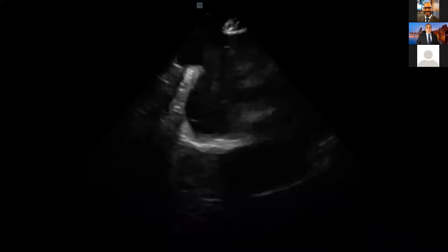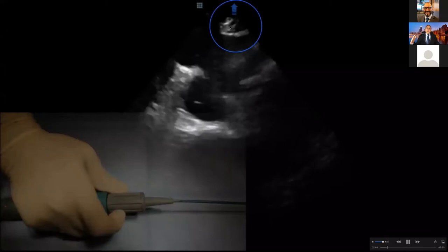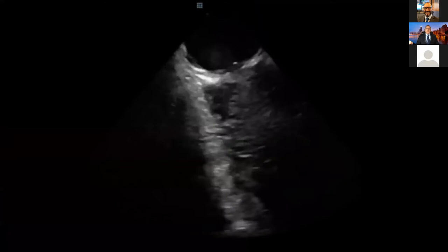Putting the ICE from the IVC to the RA can be challenging. In the normal case — 90% of the time — IVC goes straight to the right atrium with no issue. But if you don't pay attention, your ICE may go into the hepatic vein, either above or below. To avoid that, I want to get rid of the hepatic vein structure. I dive into the right atrium by performing an anterior tilt, then advance it inside the right atrium.